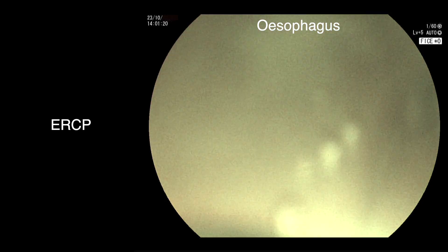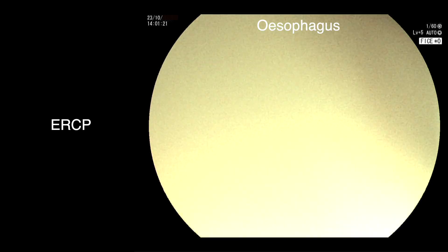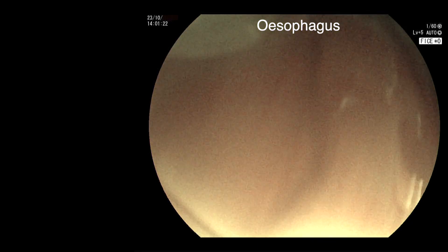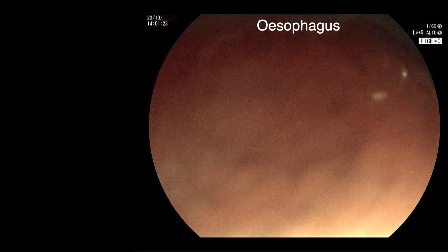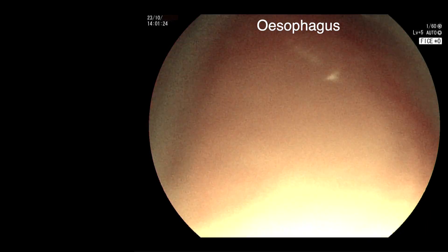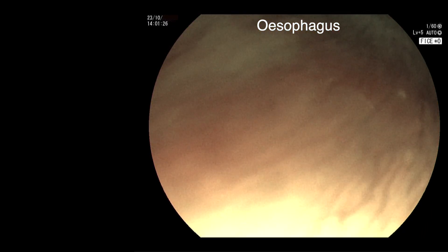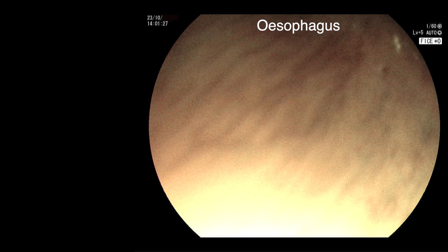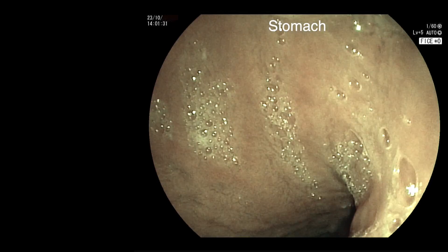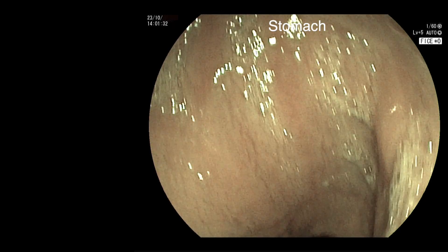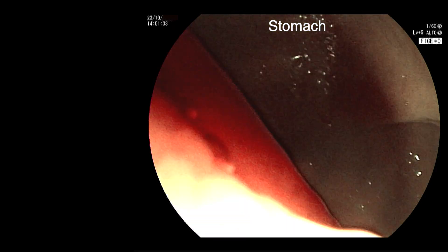We were able to use an adult duodenoscope. The current ESGE guidelines state that it is acceptable to use an adult duodenoscope in children weighing more than 10 kilograms or who are over one year of age.